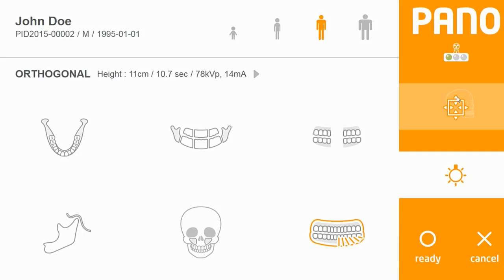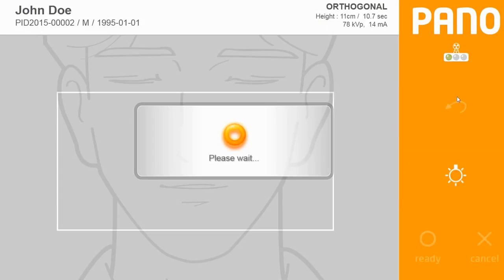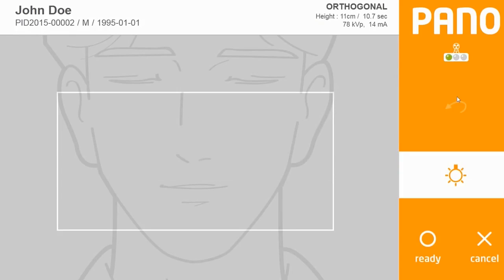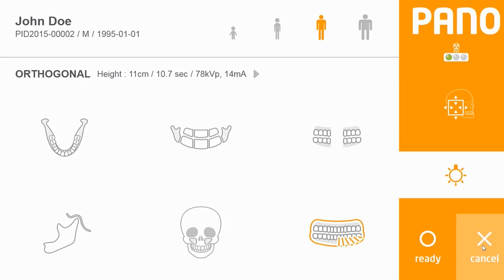In the orange section at the top, you can adjust the region of interest with the remote. You can also turn the positioning lasers on and off. The Ready button puts the machine into a ready position, and you can cancel out of this window if you choose. Once you have a patient positioned using the positioning lasers and appropriate chin rest, click Ready.